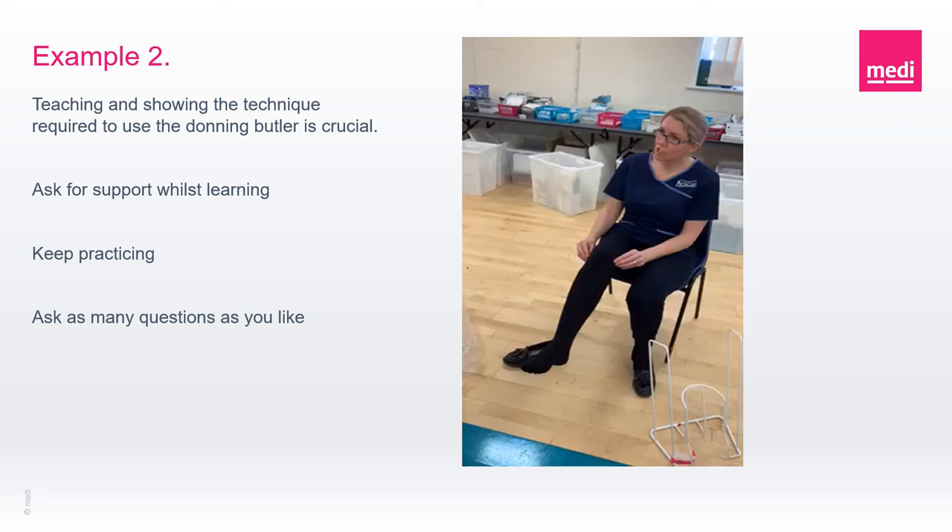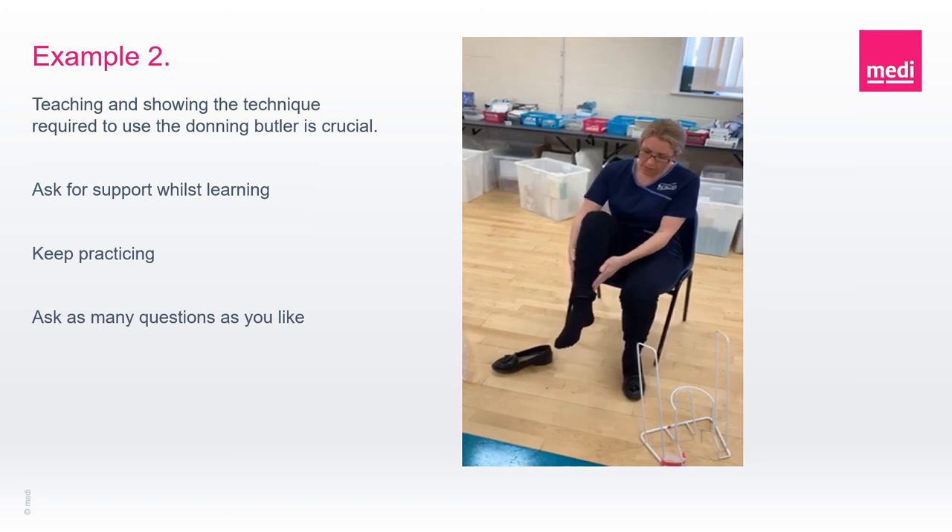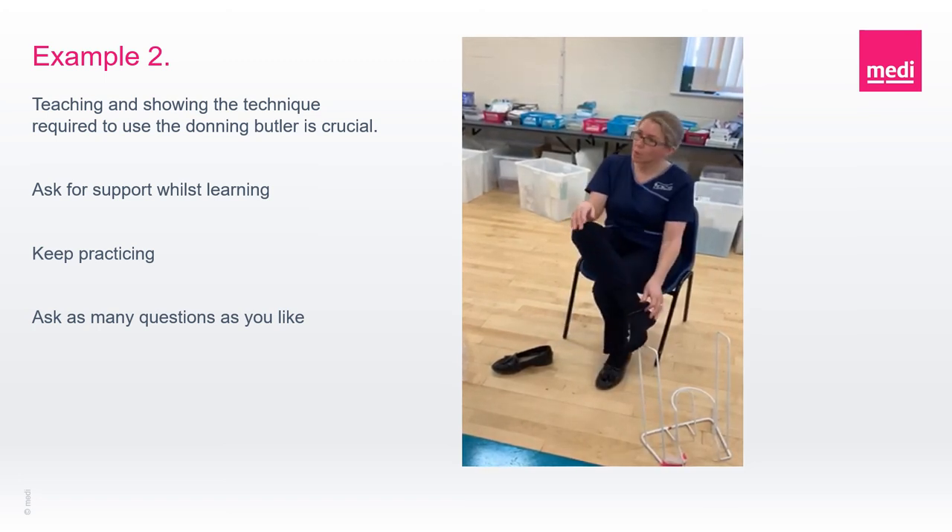Here is an example of the compression hosiery being doffed in action. You've got to push down, get a little broader out of it, pull your leg across.